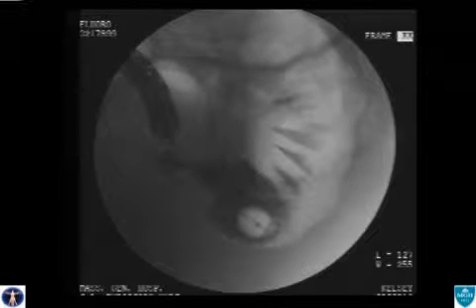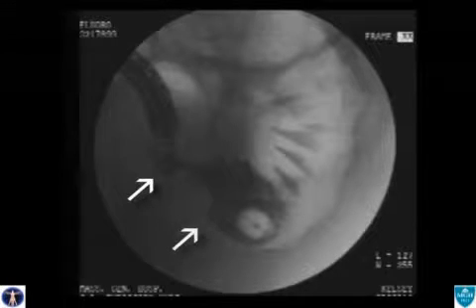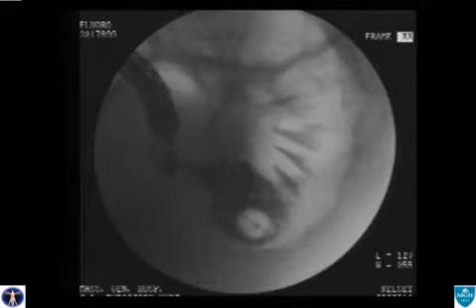With the endoscope positioned near the downstream margin of the stenosis, the space between the scope, marked by this first arrow, and the insufflated balloon, shown by the second arrow, provides a rough estimate of the length of the stenosis. This maneuver clearly identifies the position and the length of the sigmoid stenosis, which determines the length of the stent to be used and localizes the midpoint of the stenosis, which will be critical when deploying the stent.